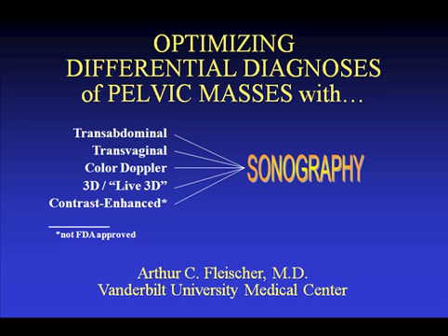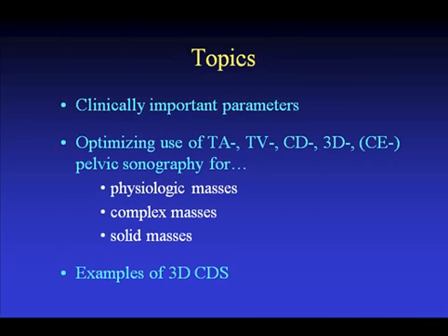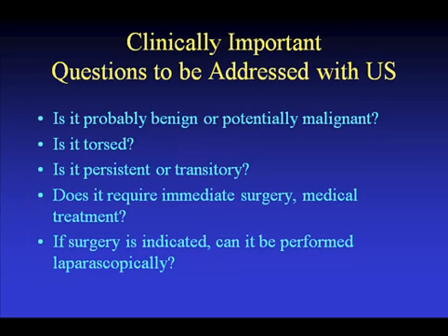3D evaluates the morphology, and live 3D is a new technique which allows us to see the morphology of lesions. And I'll just mention, although it's not FDA approved, the application of contrast for evaluating patients with pelvic masses. I'm going to emphasize the clinically important parameters in evaluation of patients with pelvic masses, optimizing the use of these various techniques, and give you some examples.